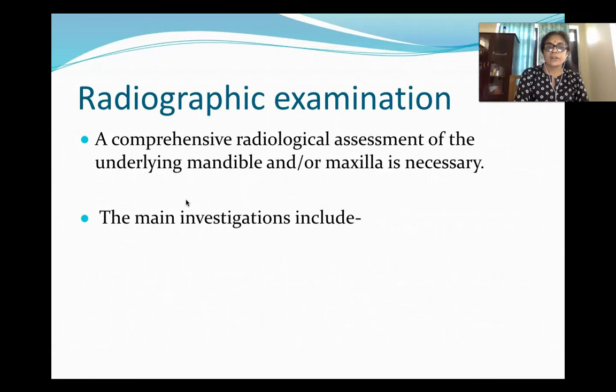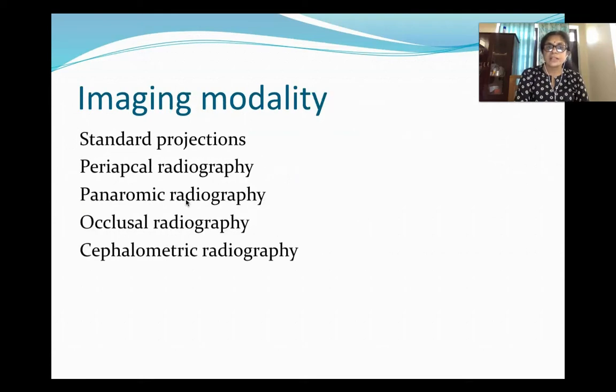Now, what are the radiographic examinations which we go through? A comprehensive radiological assessment of the underlying mandible or maxilla is necessary. The main investigations in radiology which we include are standard projections: periapical radiography, panoramic radiography, occlusal radiography, and cephalometric radiography.